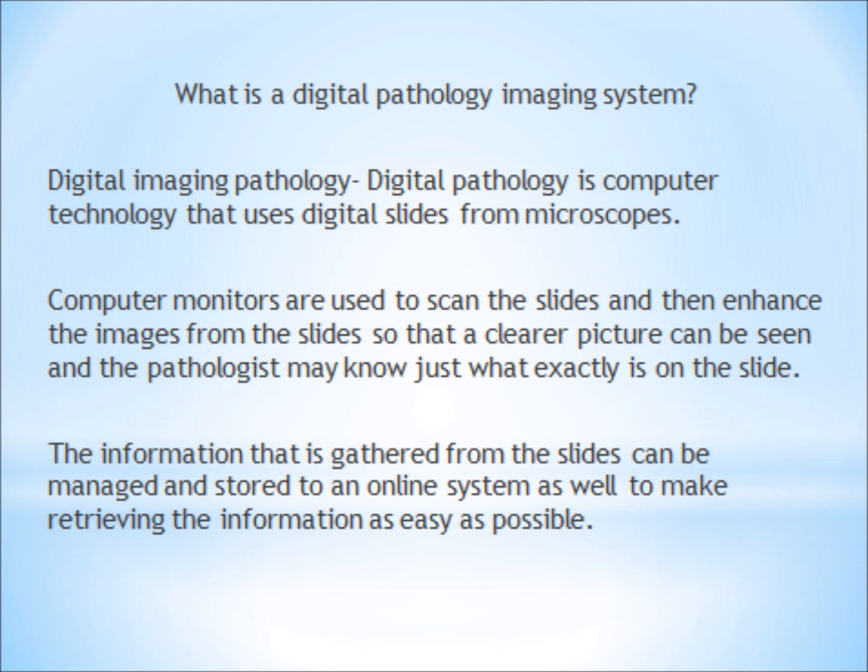And the neat thing about that is that everything that is gathered from the slides is saved and then stored to an online system, so that in the future, whenever they need to gather information from those slides, it's very simple and easy to find the slides that they need and gather that information.